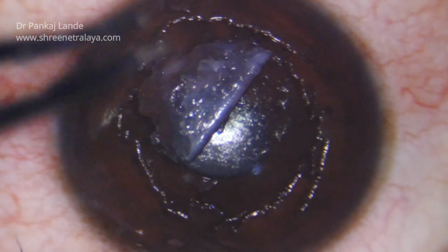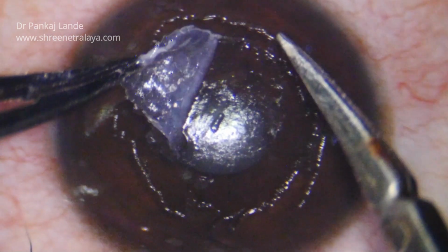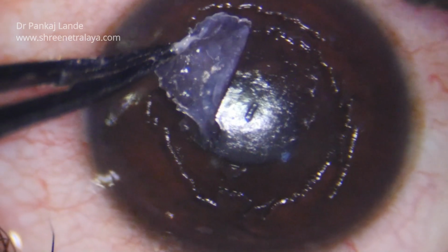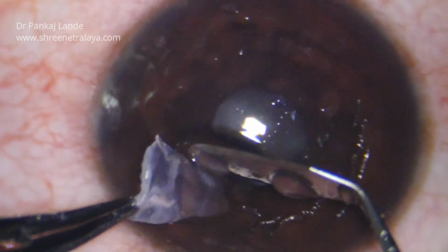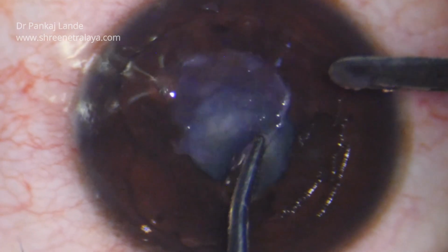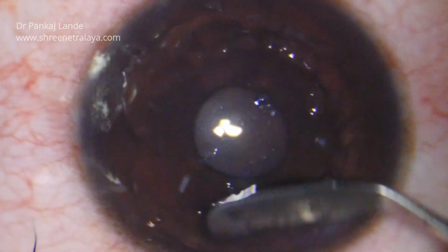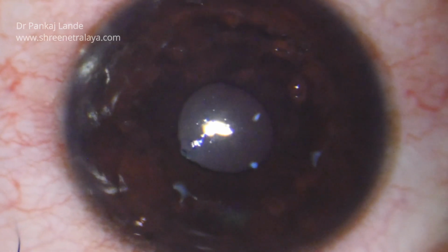Here I am using a tooth forceps to peel it off. You can use a slightly broad based forceps so that the scar should come in toto and not in piecemeal, as residual remnants of the scar may cause abrasions at a later date and diminution of vision thereby. If you have some remnants remaining, then you can use a diamond burr to smoothen the surface. Here that was not the case, so diamond burr was not utilized.